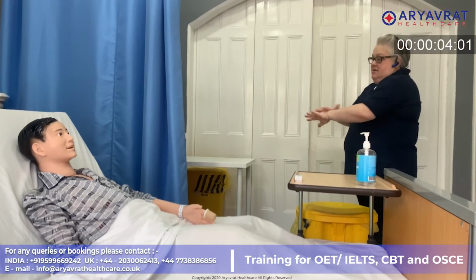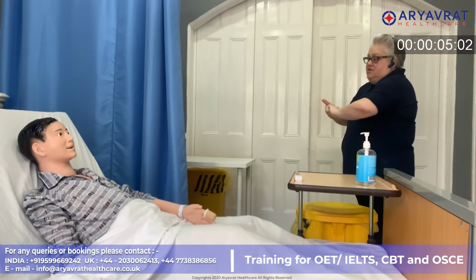Entering the room, checking for the scene safety, making sure it's safe to approach my patient and doing my hand hygiene before I approach.